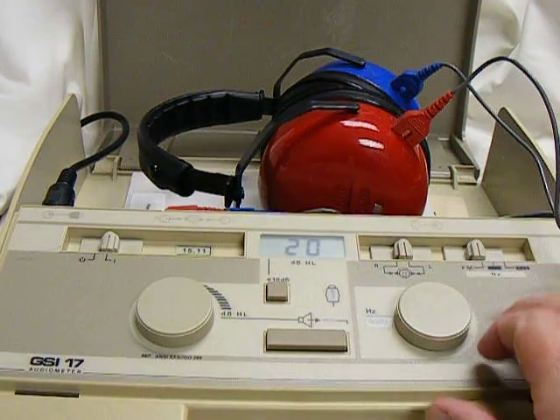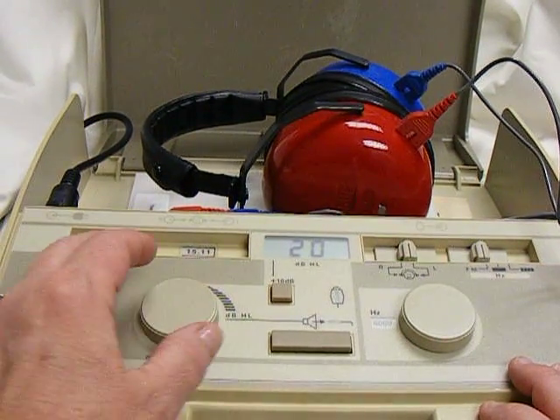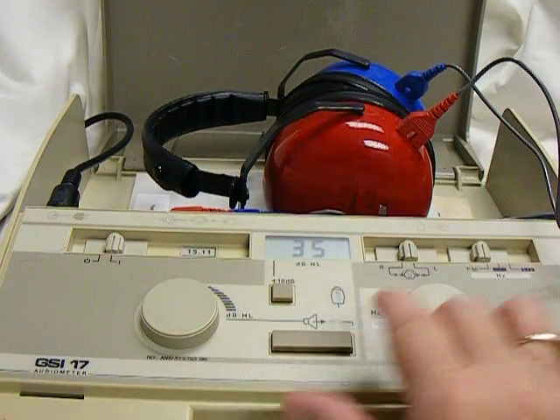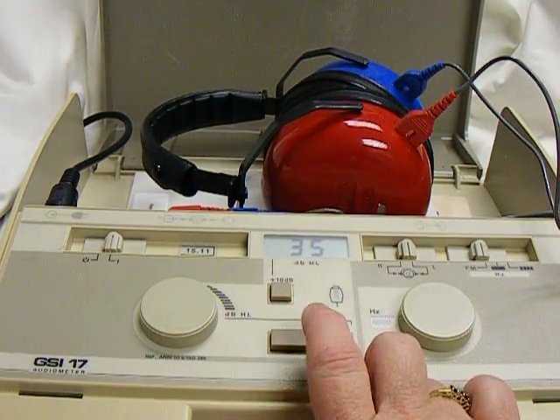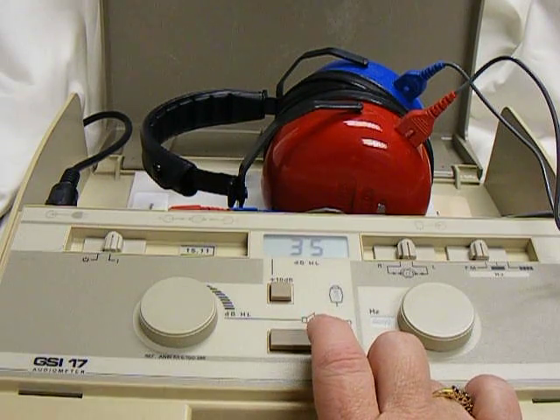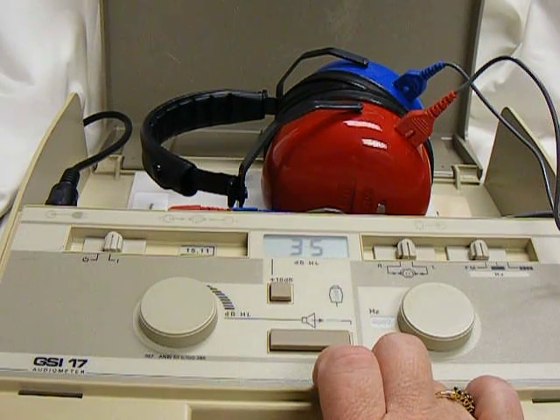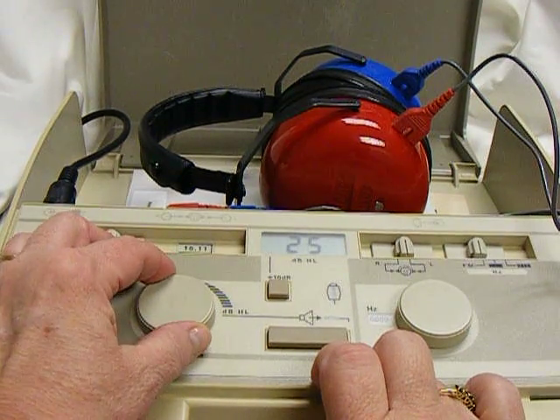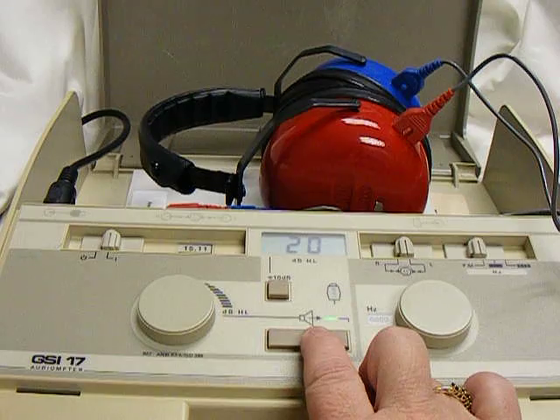Now if a student does not hear the tone at 20 dB, please go up to 30 or 35 dB and try to give the tone again. The student may not know what they're listening for, and this just helps orient them. But to pass the screening, they must hear the tone at 20 dB.